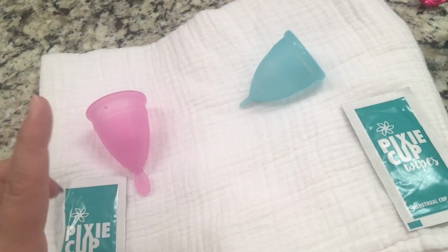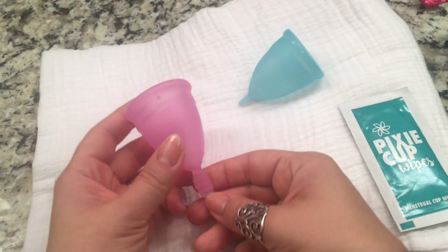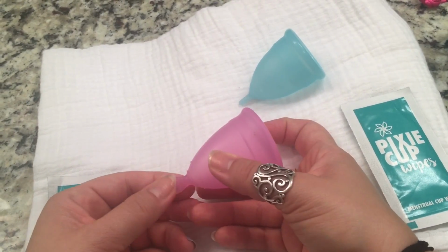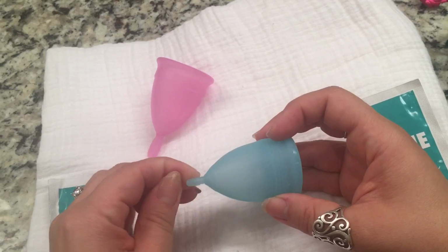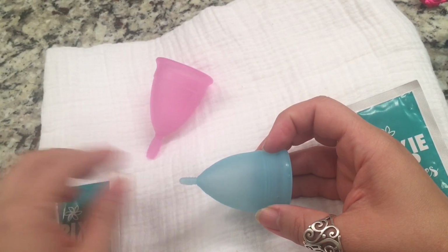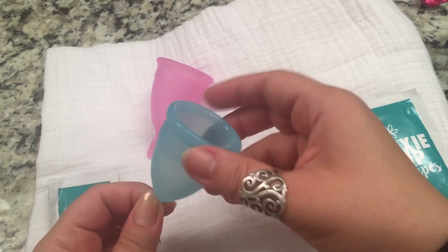If your cervix is particularly short and you feel like, okay, this is sticking out or this is just too much, of course you can cut it. But just remember, once you cut it, you can never add that material back on. So you don't want to cut it all the way up to here because then you'd have nothing to grab. So just keep that in mind. Again, I have not tried this smaller one. It's still got the ridges, but that's going to be, oops. So don't pull it too hard like I just did. But you want to be careful that you've just got something that you can grab to pull it back out.